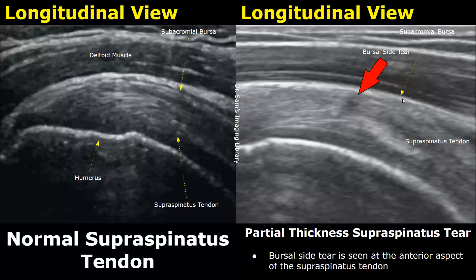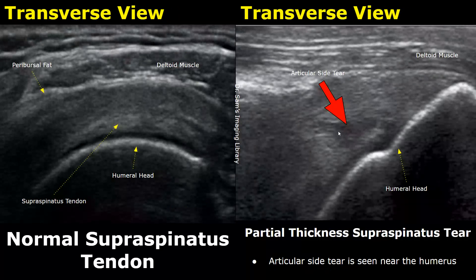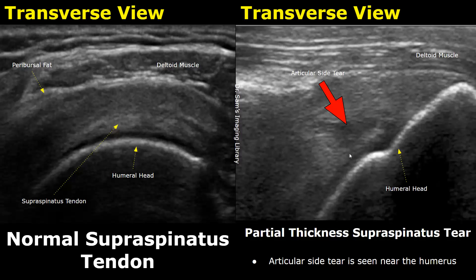This right here is the subacromial bursa. This side of the tendon is right next to the bursa, hence it is known as the bursal side. This is a partial thickness supraspinatus tear at the articular side. The articular side is right next to the humerus, so this part of the tendon is known as the articular side, and this is the partial thickness tear.